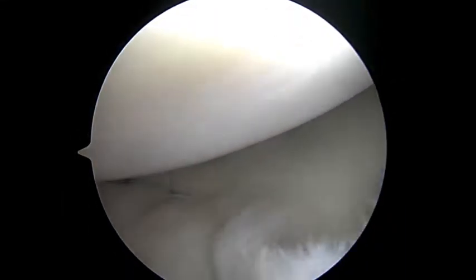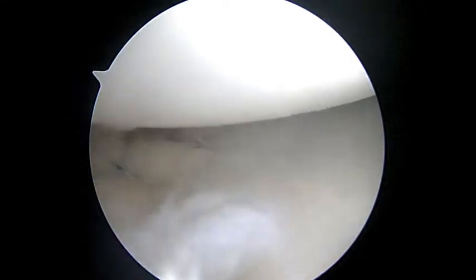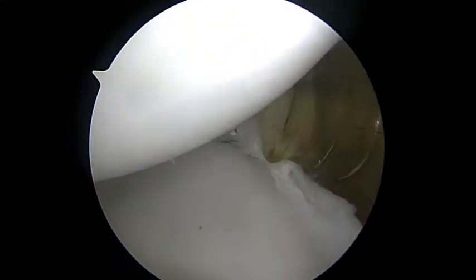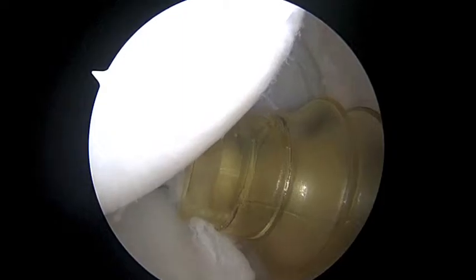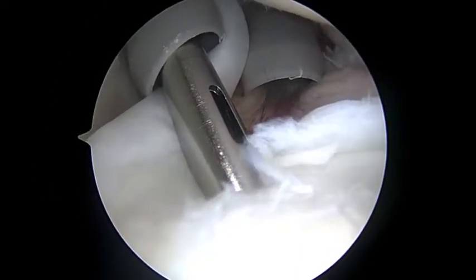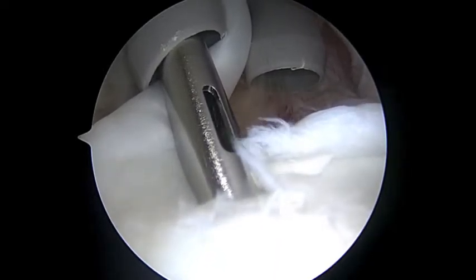There's the second suture passed and tied. We're going to go ahead and place the third — and of course, you've still got that biceps tendon anchor to worry about with the SLAP lesion also. So that's our third suture passed and tied in the front, and you can notice how much tighter it is overall. We're very happy with that. We've still got this biceps anchor to reattach, but as far as the instability from the labral detachment, I think you've got that repaired.